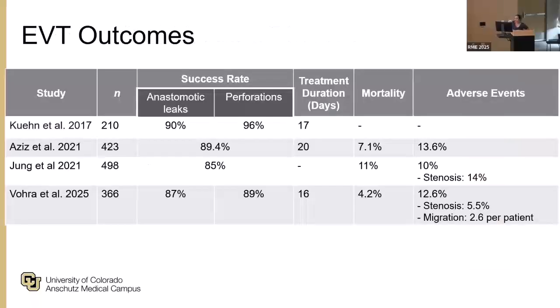This table depicts outcomes of EVT based on reviews that have been performed over the past 10 years. It shows that the clinical success rates of EVT are high, above 85%. They tend to be higher for treatment of perforations over anastomotic leaks.